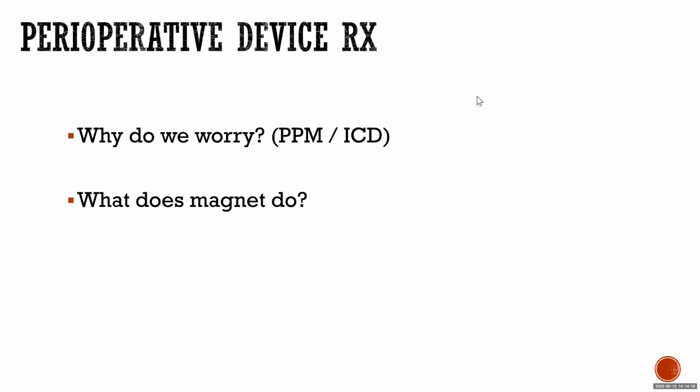Why is it a concern? Arrhythmia? Not really, but arrhythmia we worry about in any patient. Electrocautery, oversense, exactly. Cautery, good. Yeah, we worry that they will use electrocautery in the surgery. Electrocautery is an electrical field, and the device might interpret this as intrinsic activity.